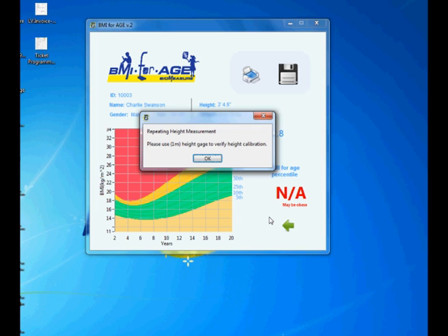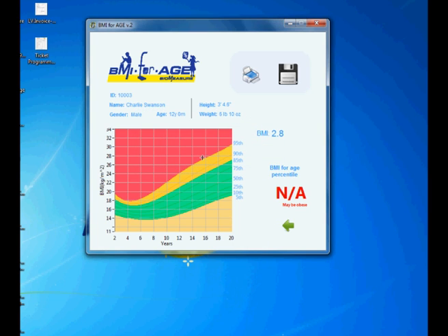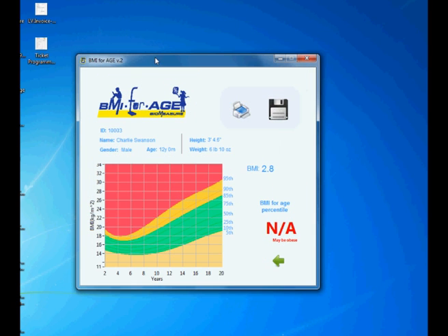So this is the error that it will give you if the reading has been repeated every time. And if it hits five times then it will give you this warning: repeating height measurement, please use one height meter gauge to verify calibration. And then once you have calibrated, make sure it's working properly. Then you can keep going with the measurements.